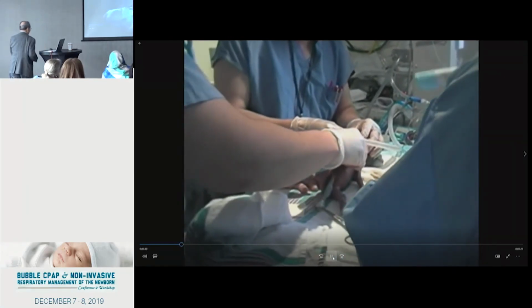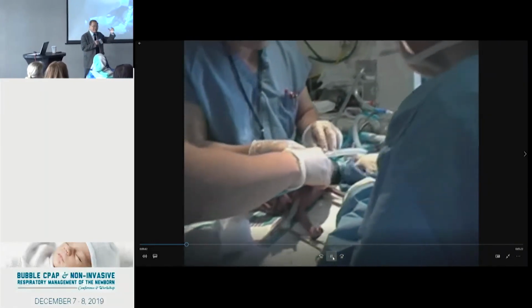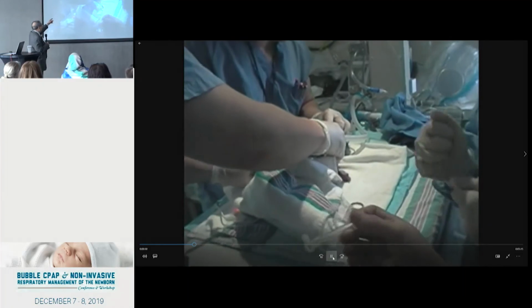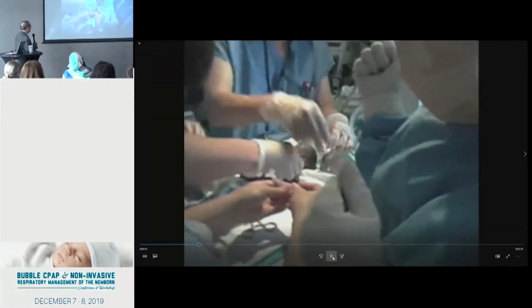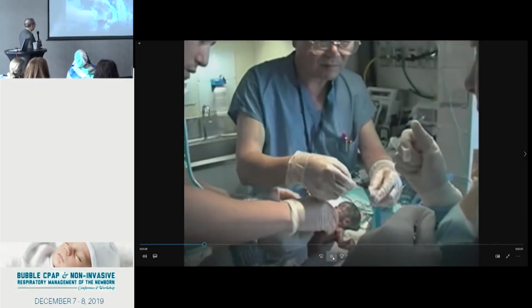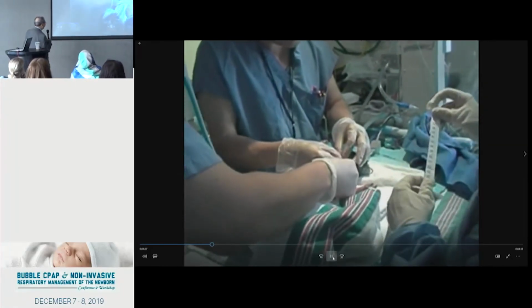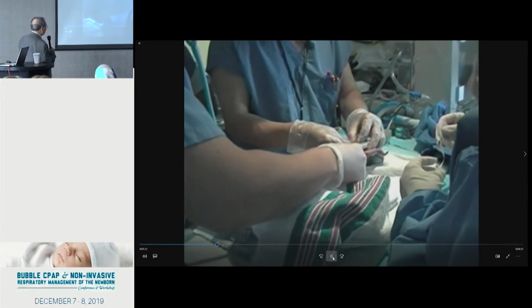You see, this our fellow, his hand is so big. And this baby kicking, moving, that he listens to the heartbeat. That's unnecessary, right? He occludes the view. Later you see I push his hand away. Okay, see, I'm not just talking, I work too, you know. Okay, I think I push his hand away now.